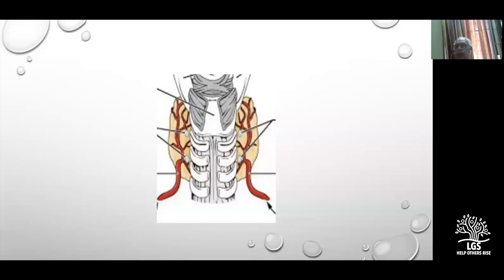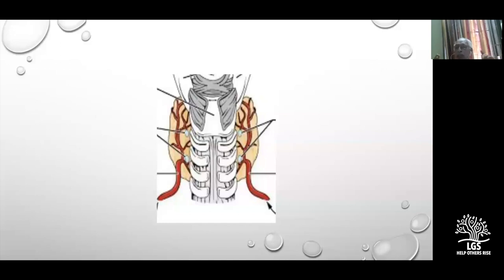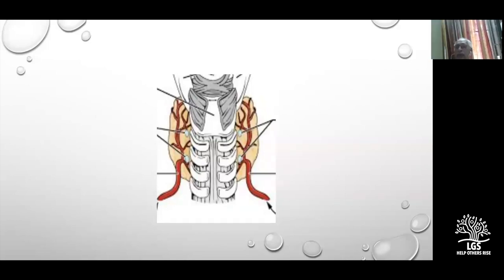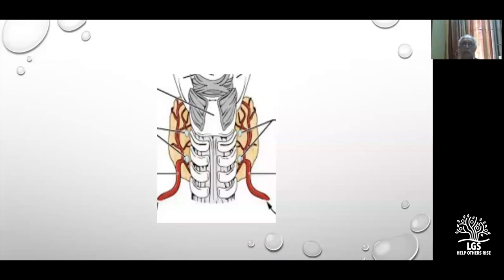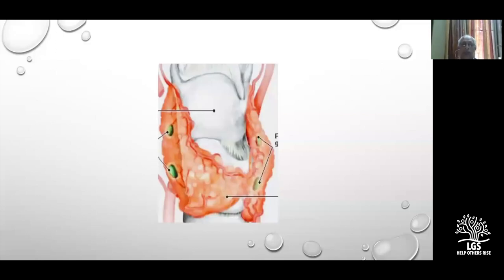At this stage, lift the gland up and you'll find tiny blood vessels running from the trachea to the isthmus — be careful. I myself made a hole in the trachea when burning one of the small vessels. Be careful when using diathermy near the posterior border of the trachea — unipolar diathermy has a scattering effect. Unlike bipolar where energy is focused, unipolar energy scatters, causing collateral damage to structures beyond the target. My anesthetist once said 'I can see the tube through your incision.' It was a small hole and I didn't enlarge it.